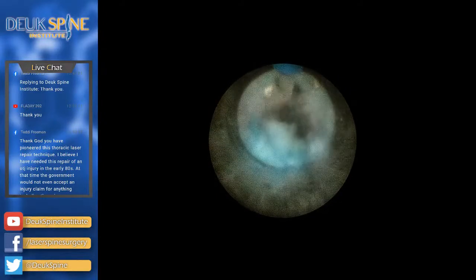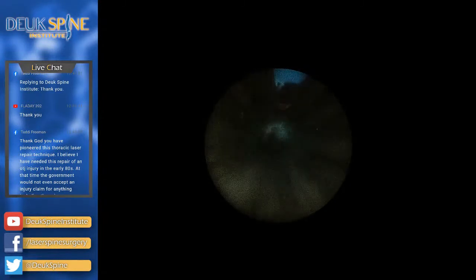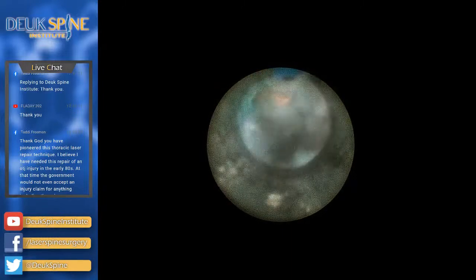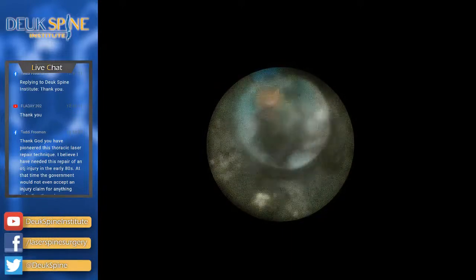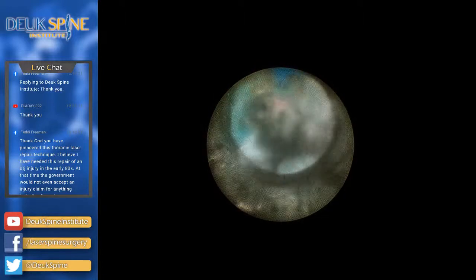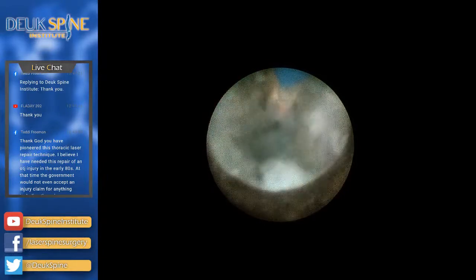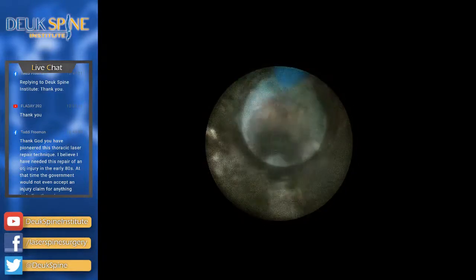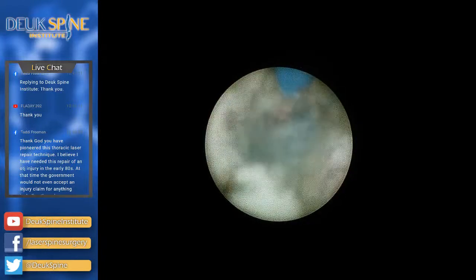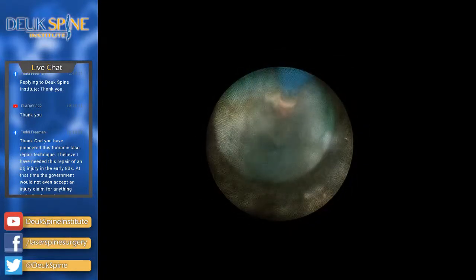Great question so far. The herniation here is good size, so it is taking me a fair amount of time to remove it. And we're not done by any means. There's still more. Okay, there's still more. And I'm not going to leave this until I feel I've done everything I should do, that I want to do, in terms of the amount that I'm removing. I'm not going to remove every last piece because that's not going to be possible to do.